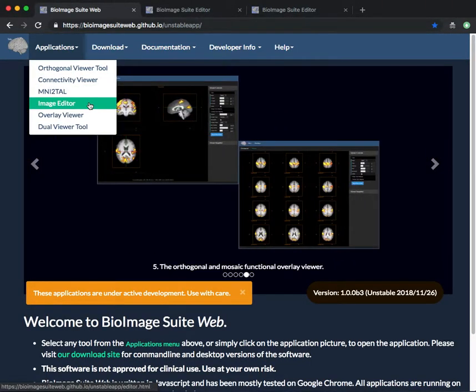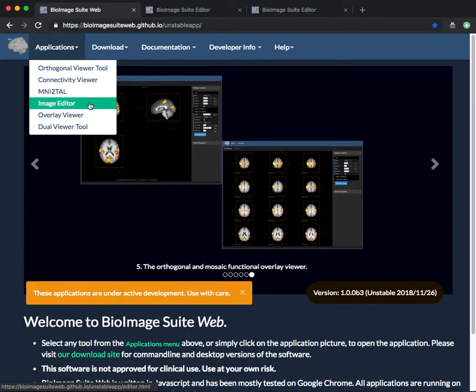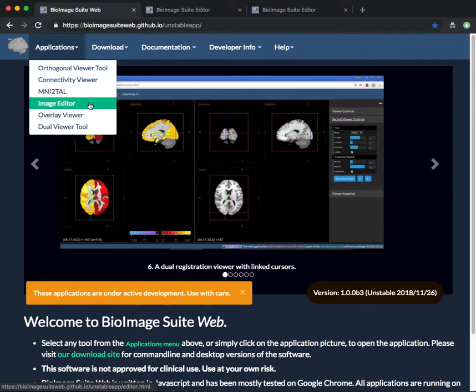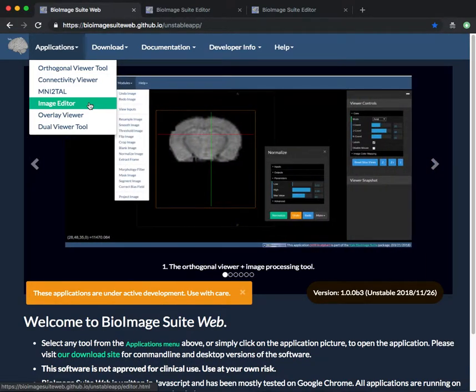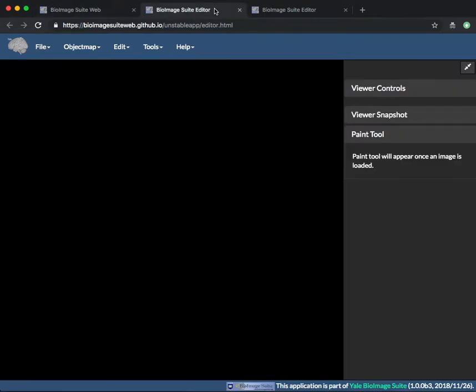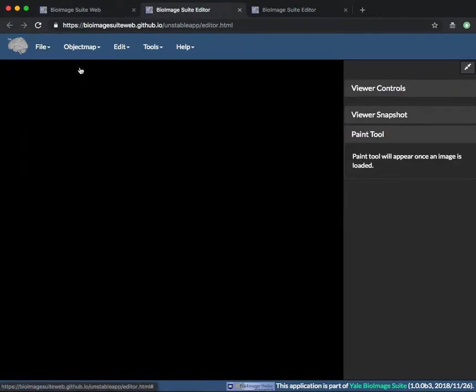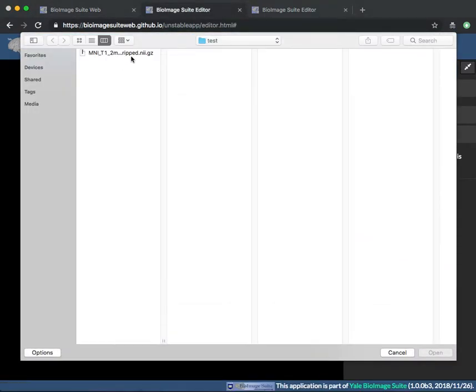The Image Editor gives you the capability of modifying images and overlays. First, open the Image Editor in BioImage Suite web. Next, load an anatomical image.